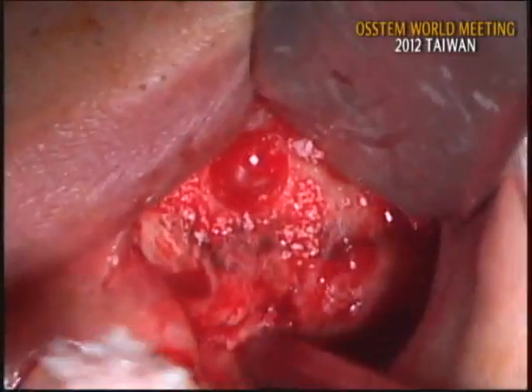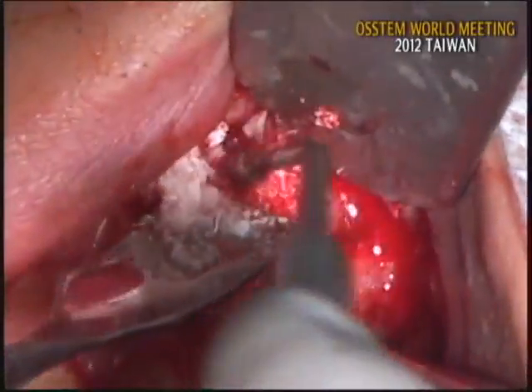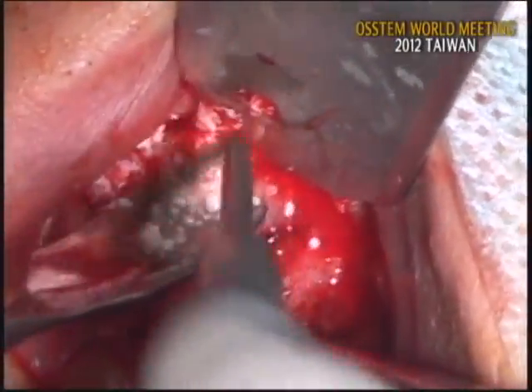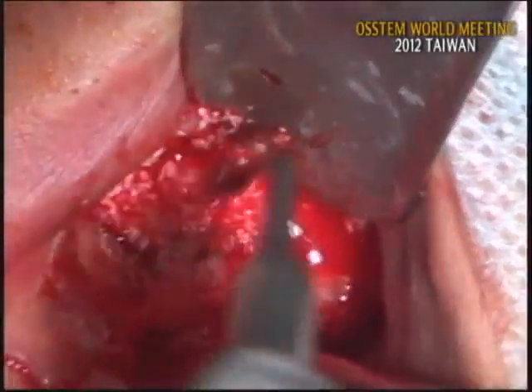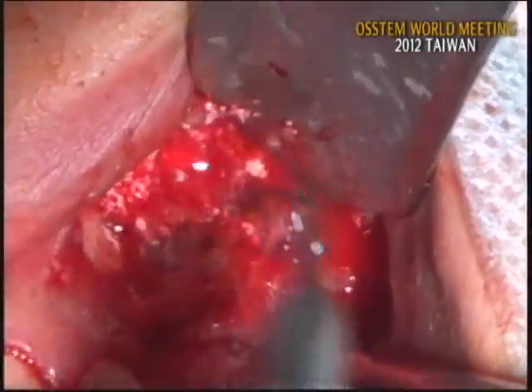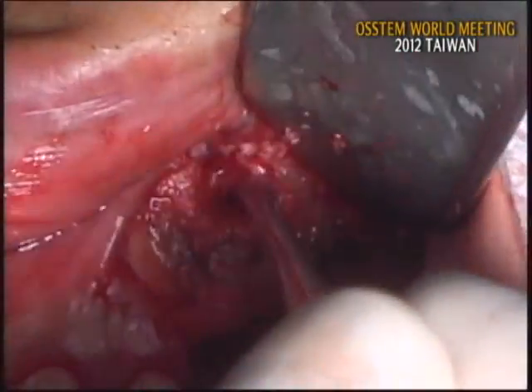Okay. Well, in the LAS-KIT, not only this core drill, but we have the dome drill. The dome drill is a grinding tool. I prefer this core drill because I can save the bone window.